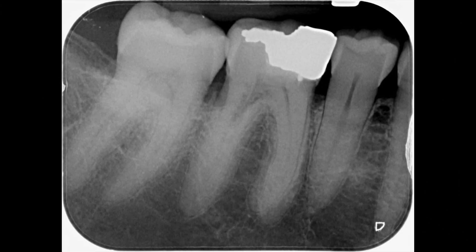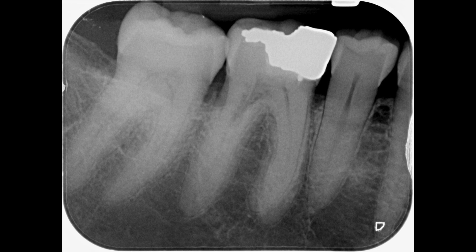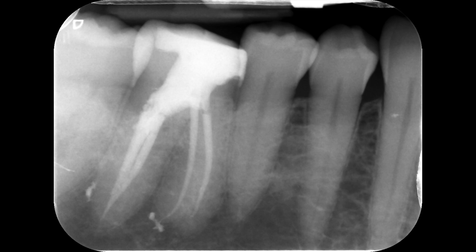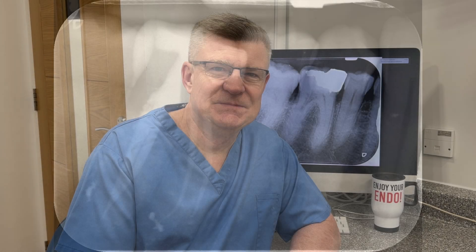Here is the radiograph showing the irregular internal resorption defect in the distal canal, and finally my completed result — the final radiograph with good coronal-apical seal and a composite restoration in the pulp chamber. Well, I do hope you enjoyed that video. Don't forget to stay tuned because there are loads more cases in the pipeline. How about subscribing if you haven't already, and above all, enjoy your endo!